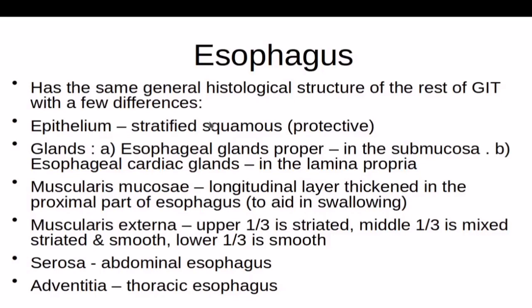Esophageal epithelium is stratified squamous non-keratinized epithelium, because this one has a protective action against the abrasive nature of the food bolus as it passes down the esophagus.